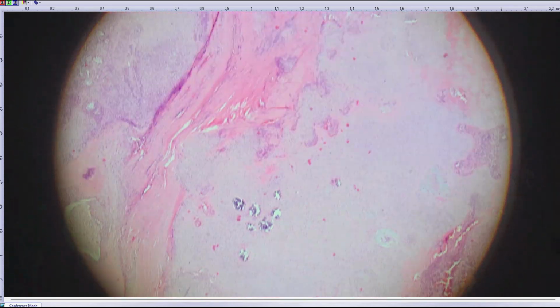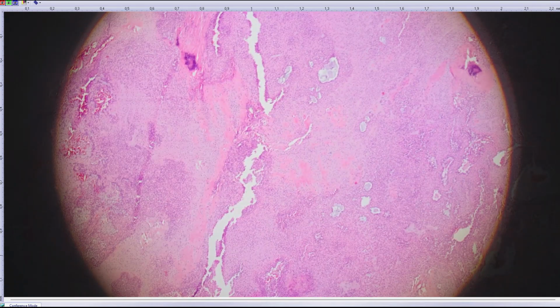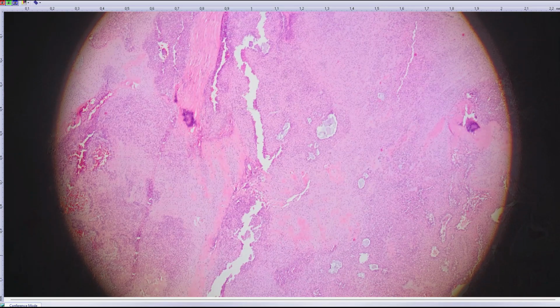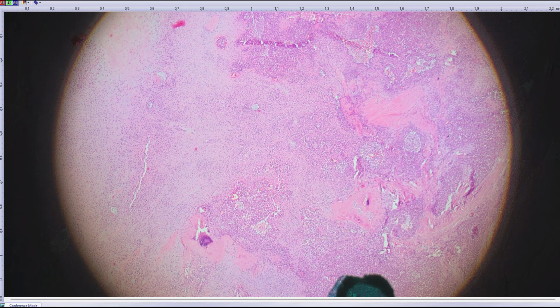Could be something else, maybe could be chondroblastoma, even though the clinical presentation is quite unusual in the rib, although it's not impossible. Older guy, we should see chondroblastomas in skeletally immature. This was a 57-year-old guy, but we solved it with molecular genetics. We tested for H3F3A and B mutations, and the B mutation was positive. There was a substitution in the protein position 36, lysine exchanged for methionine.